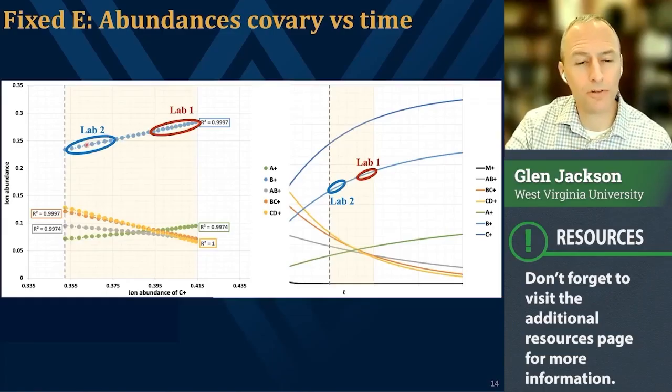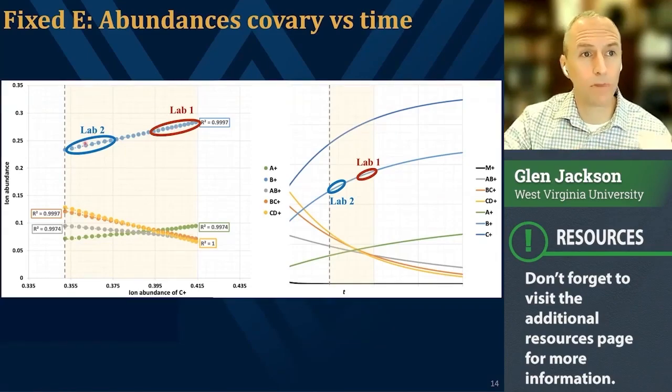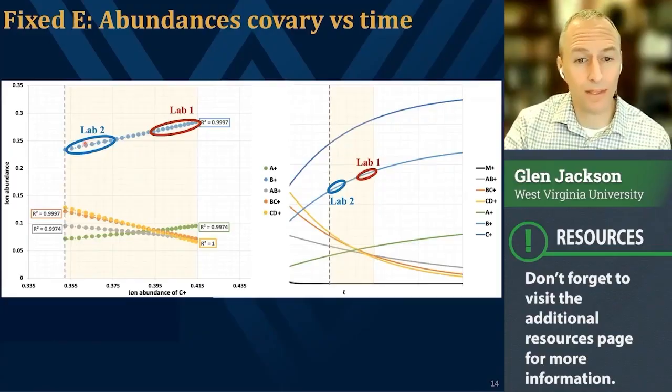And that's the fundamental difference between this algorithm and pretty much all of the algorithms: we attempt to make measurements within one laboratory, assess that variance, and then extrapolate to other conditions outside of that to make predictions.